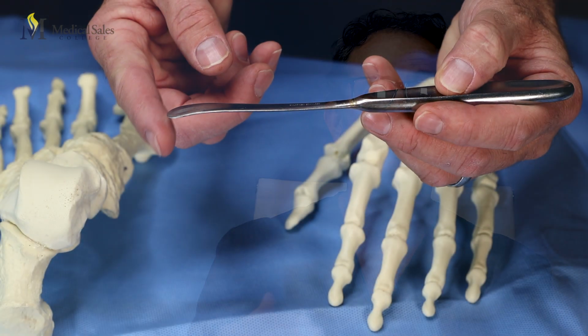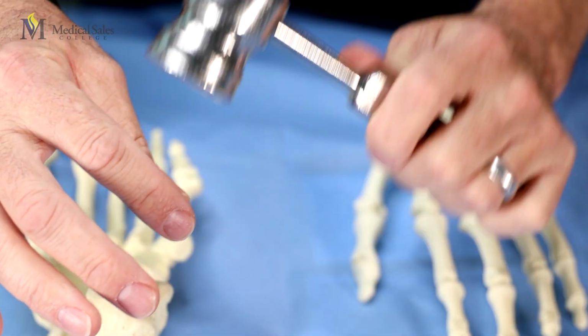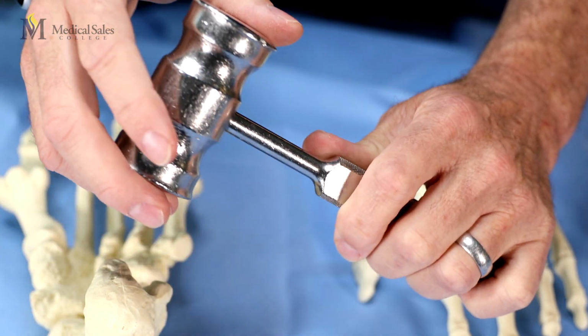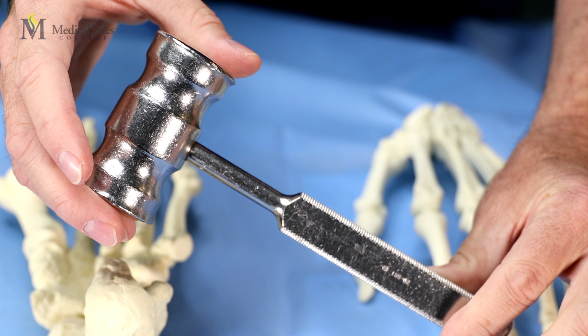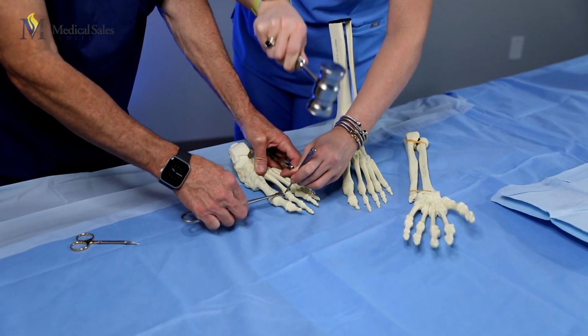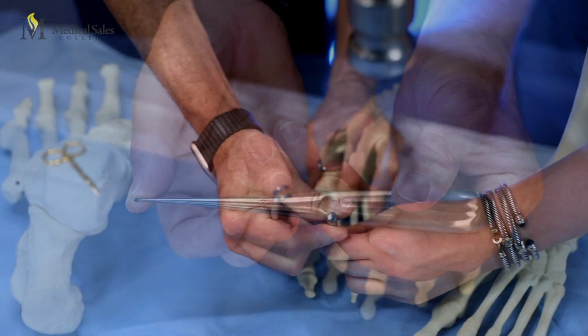Next, we talk about elevators, and elevators are used to separate or elevate tissue from bone. Mallets are an impaction type of hammer instrument that is used to impact various bone grafts or other types of hard tissue, and also are used as a hammer-like object to cut through bone with osteotomes.